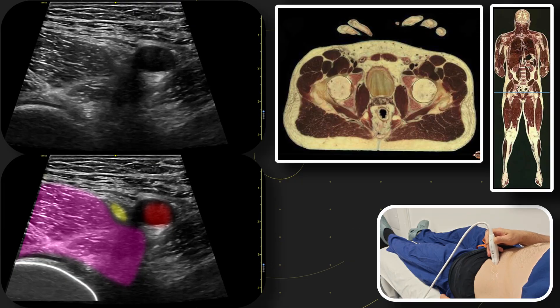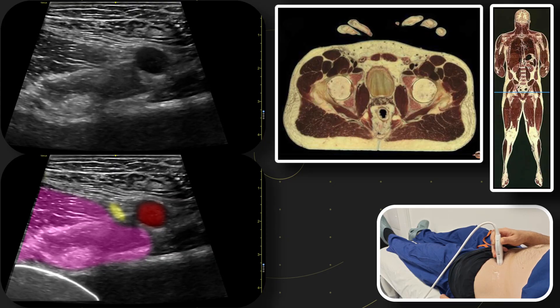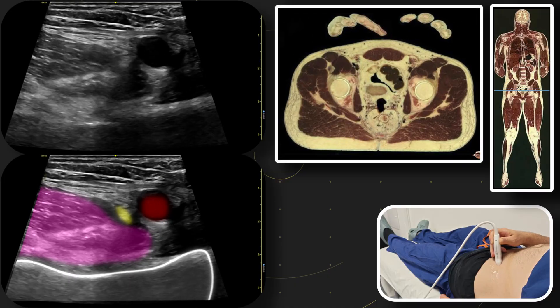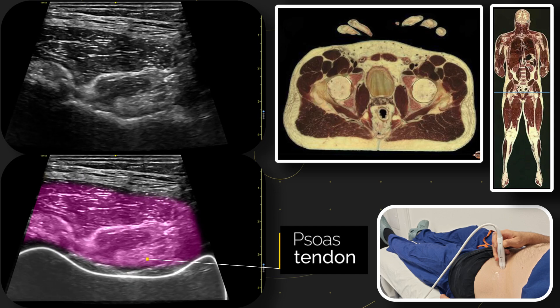There are a couple of other interesting structures here. As we slide and tilt the probe, we'll see the interaction between the femoral head and acetabulum becoming the pelvis — the view you'll be looking for when performing a PENG block. As we do this, we'll see the changing structures of the iliacus and psoas muscles, and the psoas tendon.